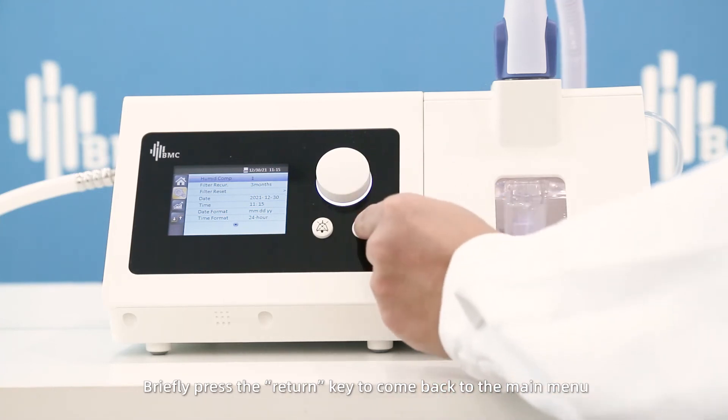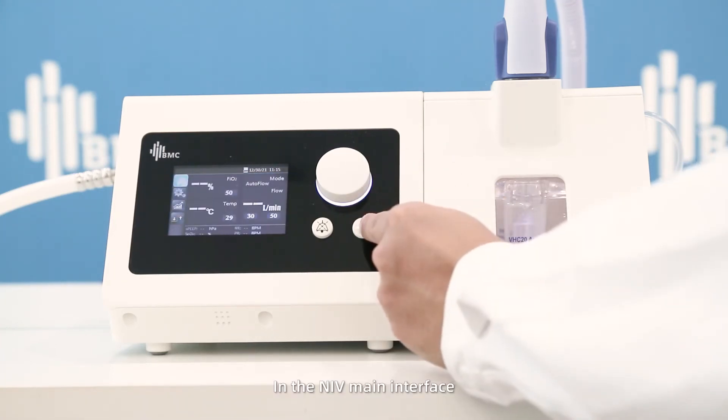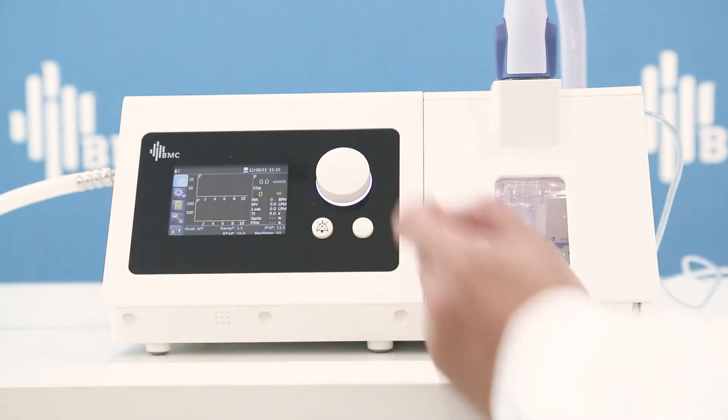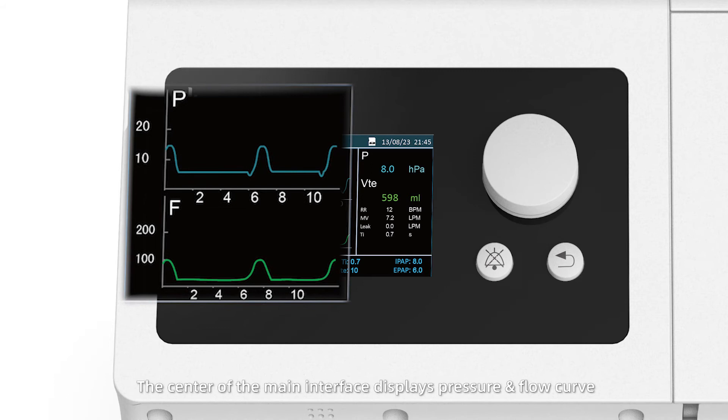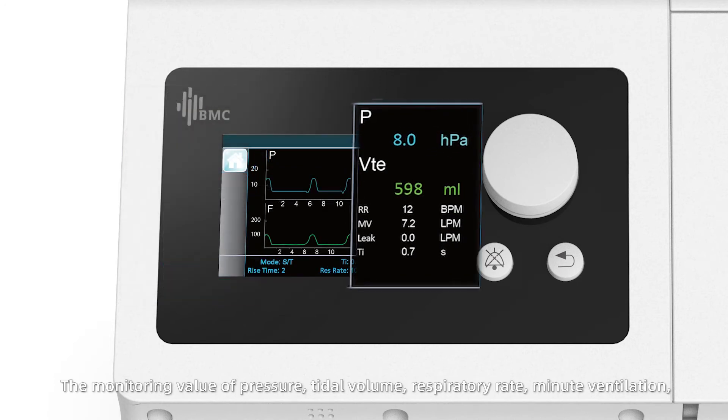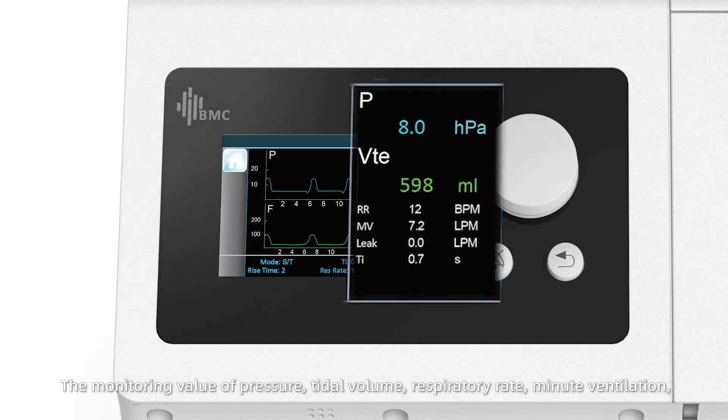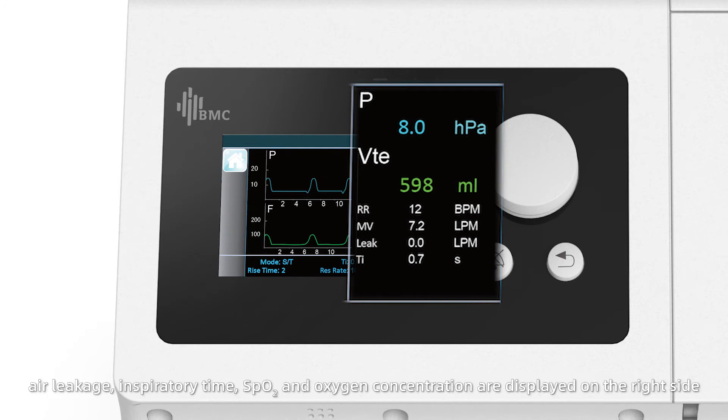In the NIV main interface, the center displays pressure and flow curve. The monitoring values of pressure, tidal volume, respiratory rate, minute ventilation, and air leakage are shown.